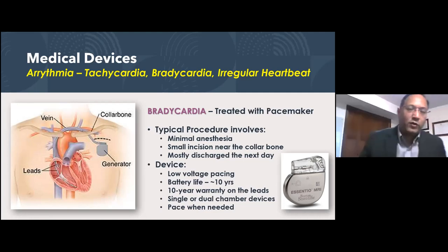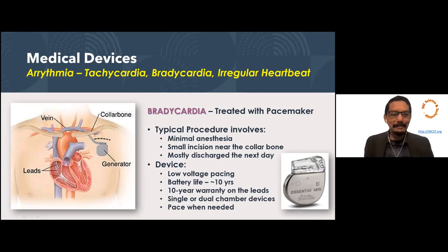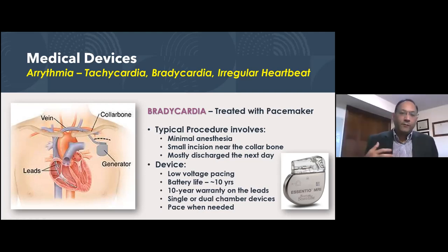So yes, no, thanks for bringing it up. I had not put it in there. So these devices have got, you can see some wires in there. These are actually antennas, RF antennas. So outside you have a small device which is connecting to this pacemaker over RF.